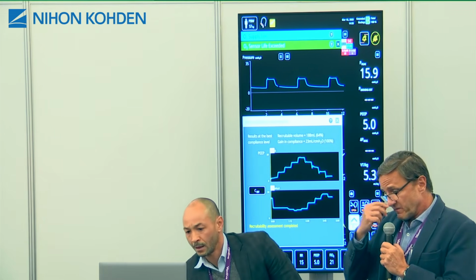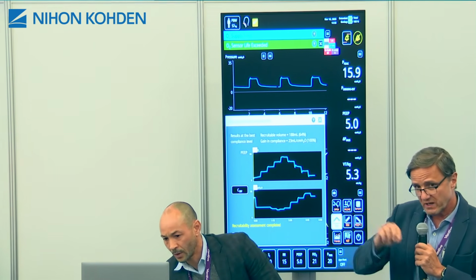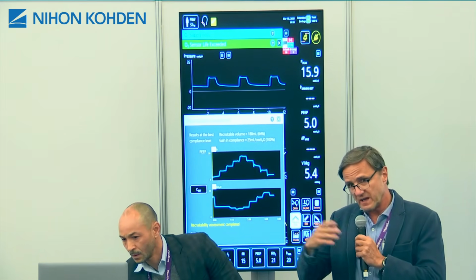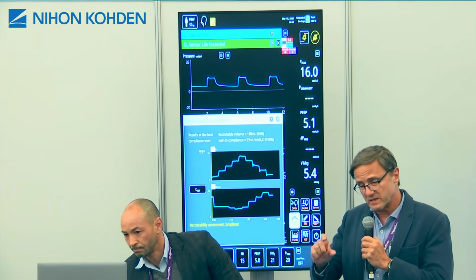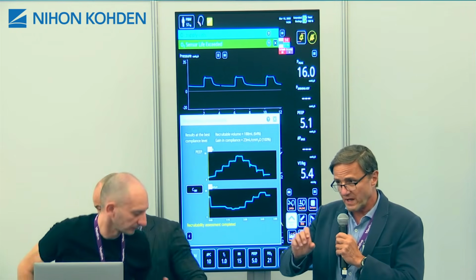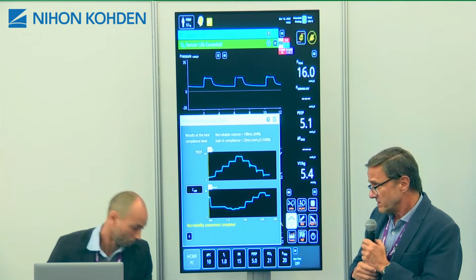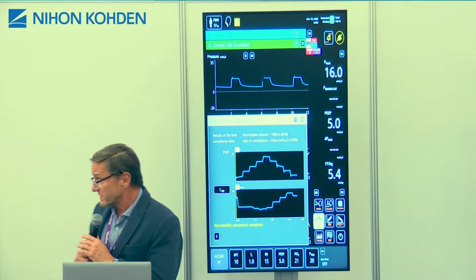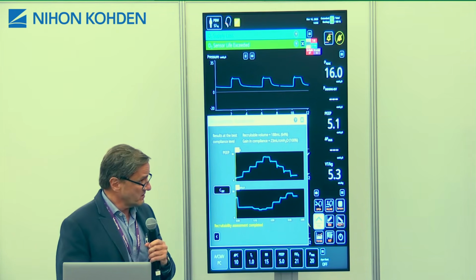And then we tried to establish some boundaries to see if, let's say, the gain in compliance could be related to a certain amount of collapse reversal. So let me show you this study. It's going to take 5 minutes and we can understand how it works.